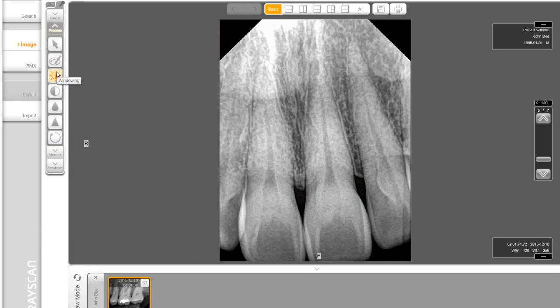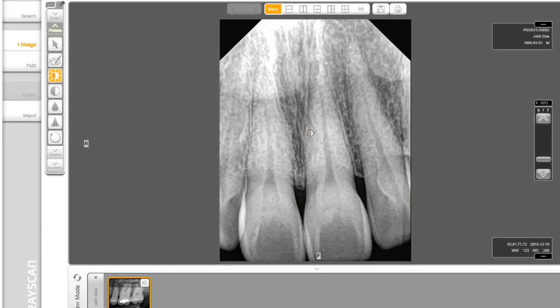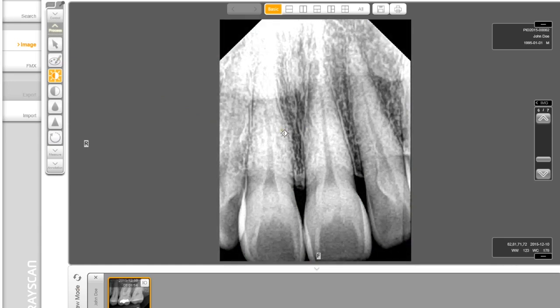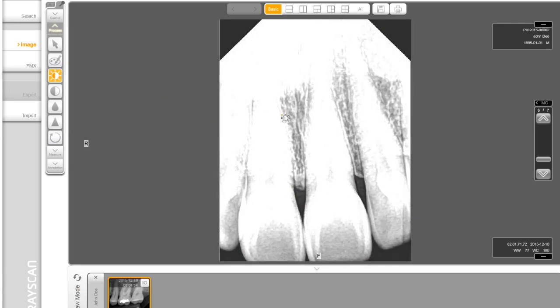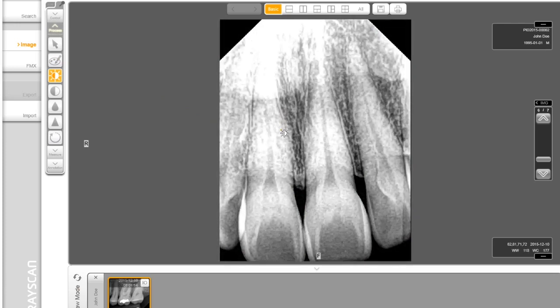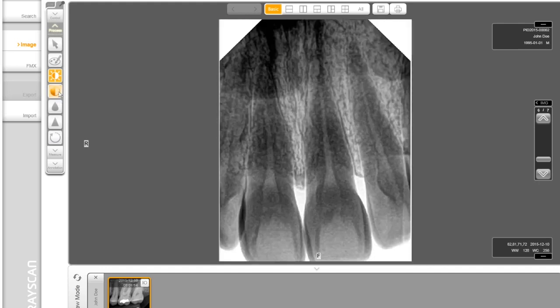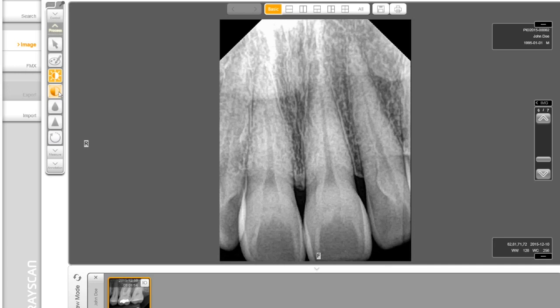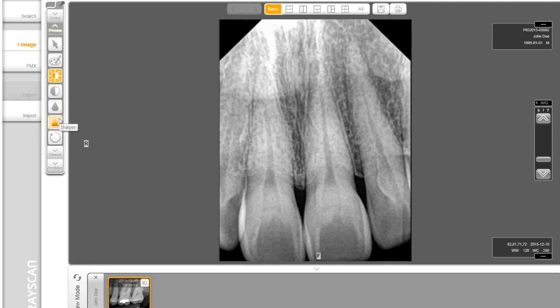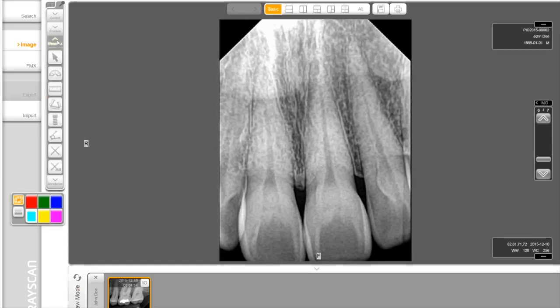The next section is Process Tool. Windowing button allows the user to click and drag on the image to adjust the brightness and contrast. Dragging left and right adjust the contrast and dragging up and down adjusts the brightness. Invert makes whites to black and blacks to white. You also have Sharpen and Median options.